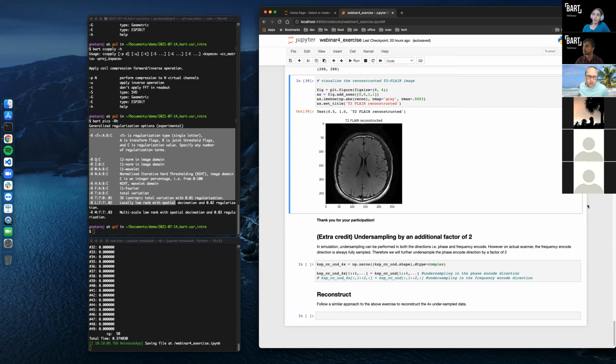Gopal, can I add something? Go ahead. So Natalie, I think you mentioned that you were using version 4 previously, and now you're using the most recent version, which is 7, right? Yes. So there have been a lot of changes. Version 4 is really outdated by now. In addition to what Gopal said, I suggest sending a message to the MRI.recon mailing list.